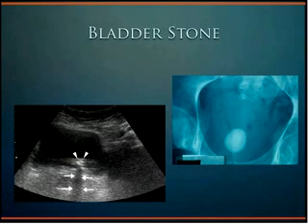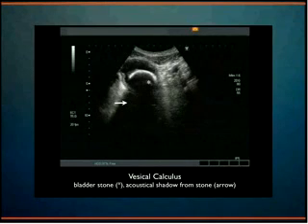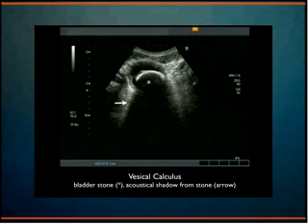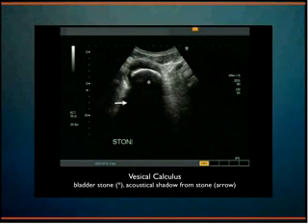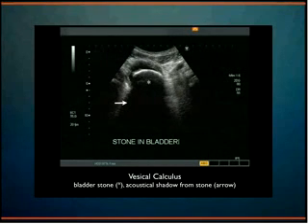This 77-year-old female from a nursing home came in with abdominal bloating. Plain films were taken with concern for constipation, and this mass was seen in her pelvis. The ultrasound on the left depicts the bladder stone with prominent shadowing. This is a 69-year-old, otherwise healthy female who had urinary urgency for 6 months. You can see within the lumen of the bladder there is an echogenic calculus, which represents a bladder stone. There's acoustical shadowing seen posteriorly from the stone.